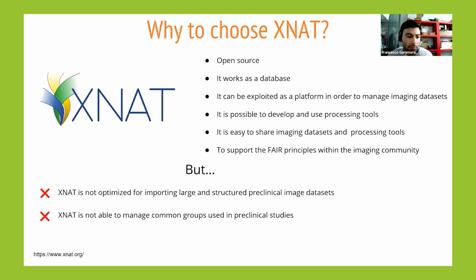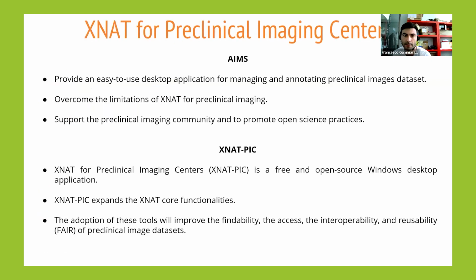But the problems are that XNAT is not optimized for importing structured preclinical imaging datasets, and XNAT is not able to manage common custom variables such as groups, time points, and doses used in preclinical studies. So our aim is to provide an easy-to-use desktop application for managing and annotating preclinical image datasets.